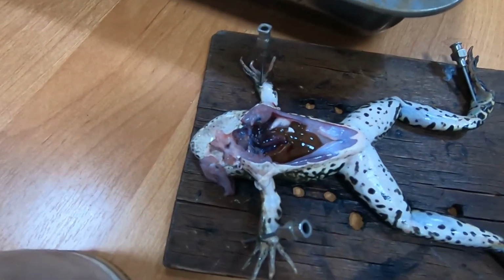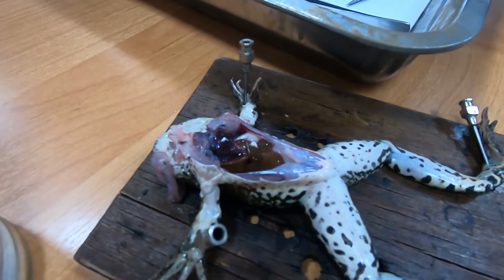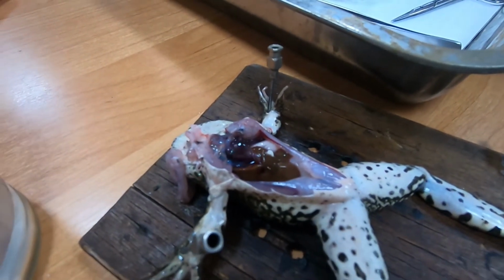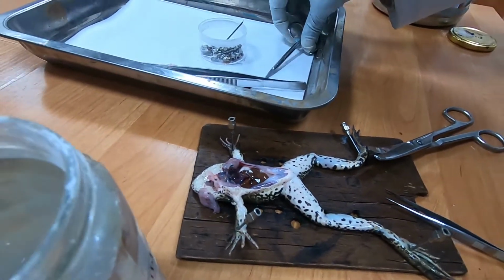So, can you see how the heart is beating? To show you that the heart works independently, we are going to remove it from the thoracic cavity.